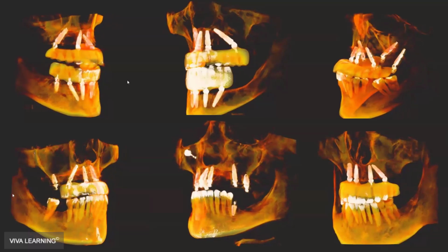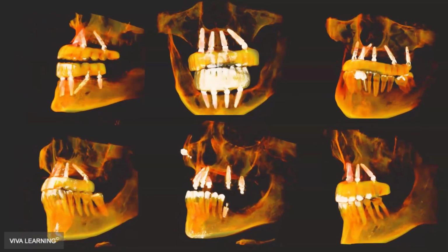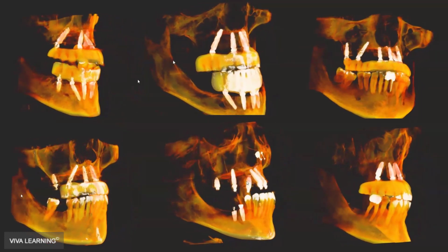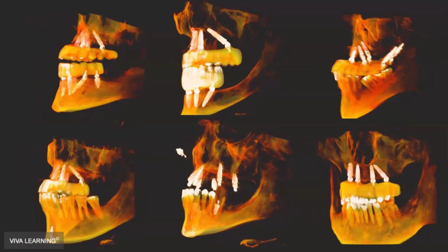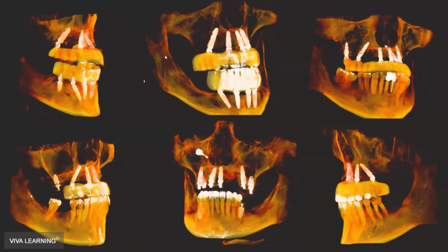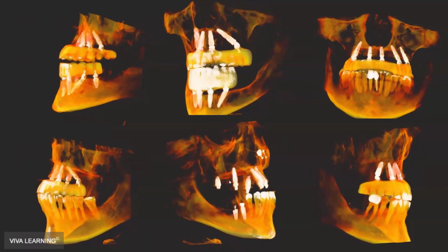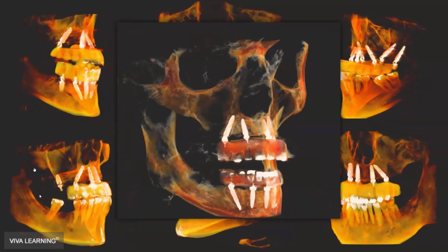These are x-rays I took on a 12 by 10, and it's amazing what you can see in a 12 by 10. That's probably the minimum I think you need to have to do full arch. So these are cases I've done in the last couple of months. You can see the entire body of the mandible. You can see to the top of the sinuses on most patients. Can't quite see the TMJ on both sides, but you can do adequate full arch surgeries at a 12 by 10. The new Optima scan, a little bit larger.